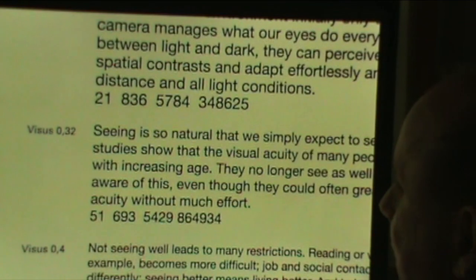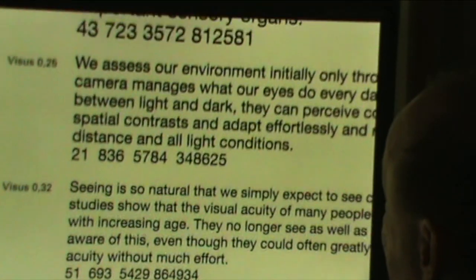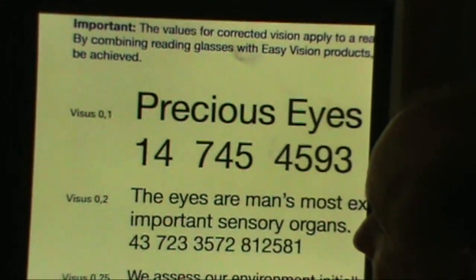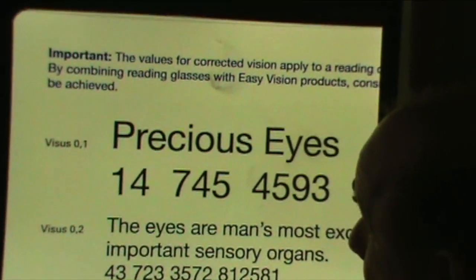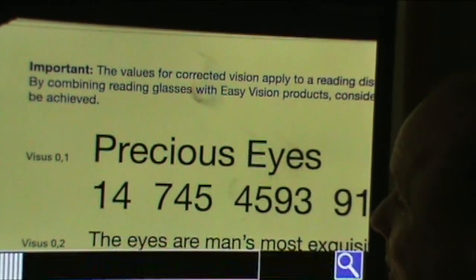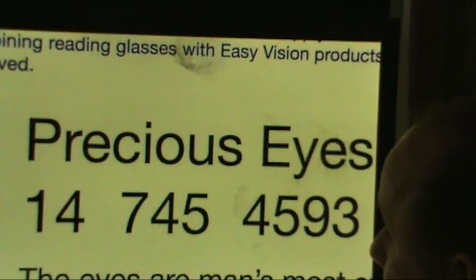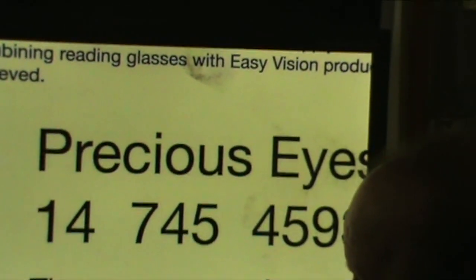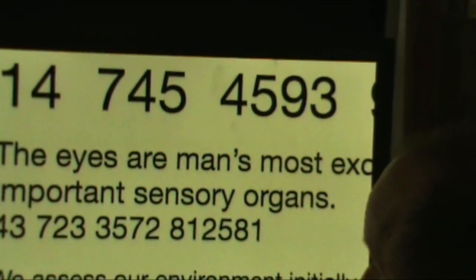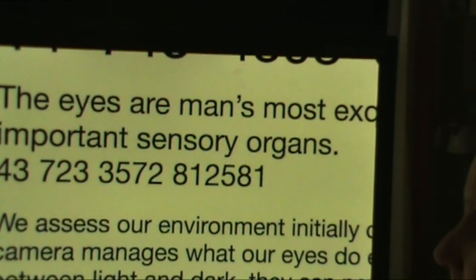And we're looking at, and I'm going to adjust the table just a wee bit so that we can physically move the table so we can get a representation of the larger print on this system. So we'll go ahead and magnify this again so you can get a good idea of how good the magnification level is.